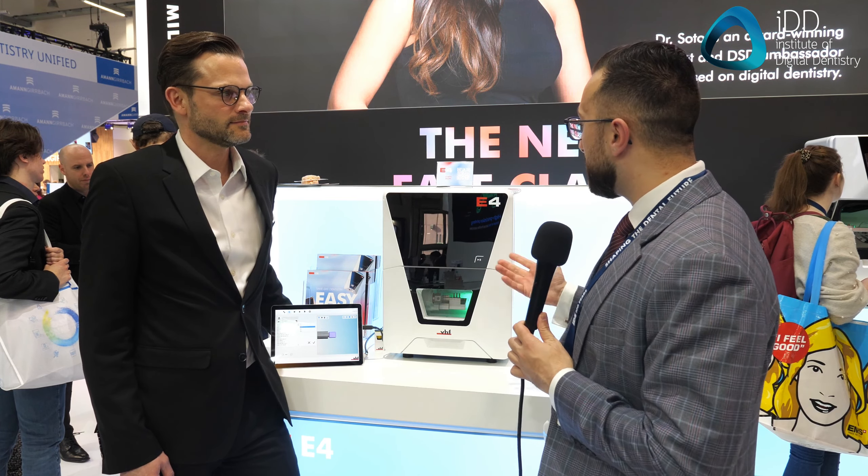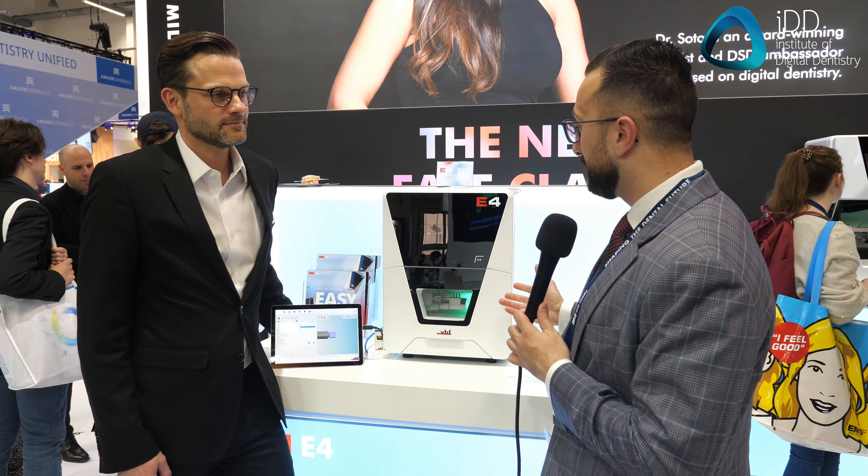As a continuation of what VHF released at IDS 2023, this is the E4 — their newest chairside milling machine. When you look at the size of this thing and keep in mind that it doesn't need a compressor, you can see that the company is very serious about this being a chairside mill. We are very excited about the E4 too. It's the second machine in our new E-series. The goal was to have a milling machine for the chairside application that is super easy for dentists to use, to get installed, and to operate, and even to maintain.